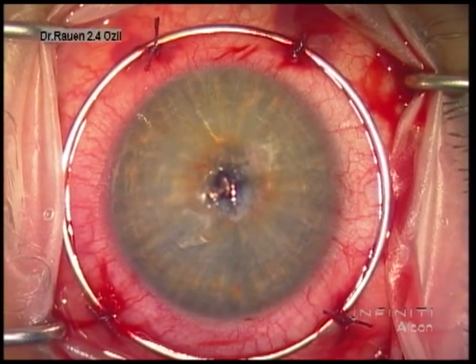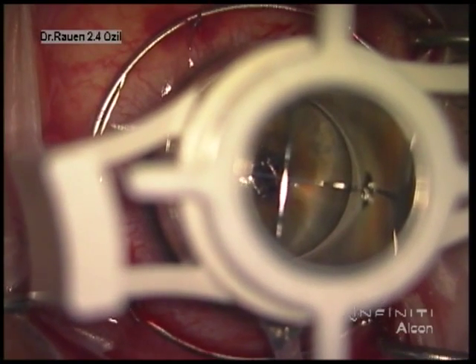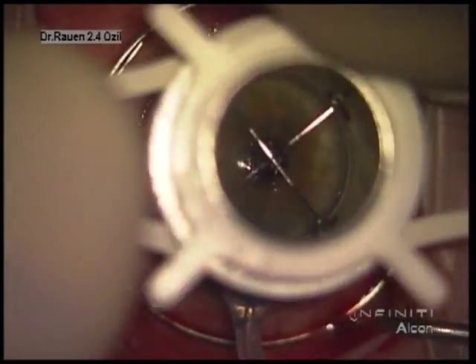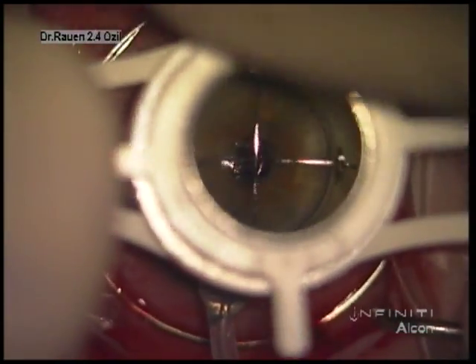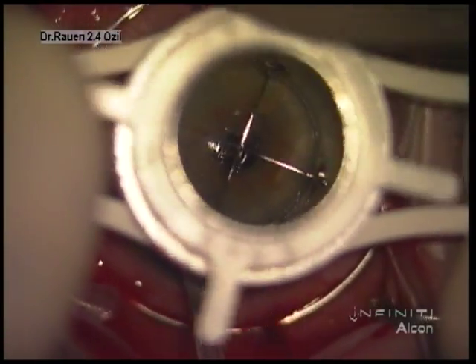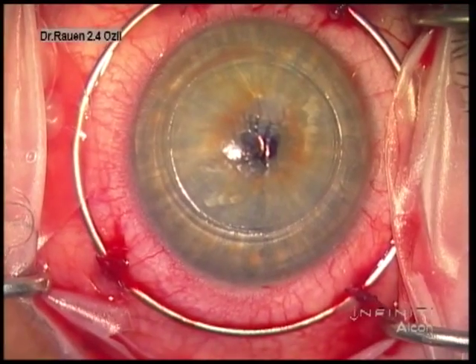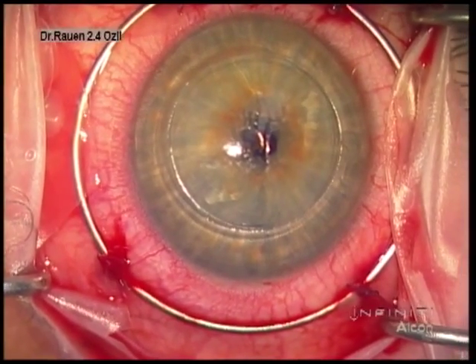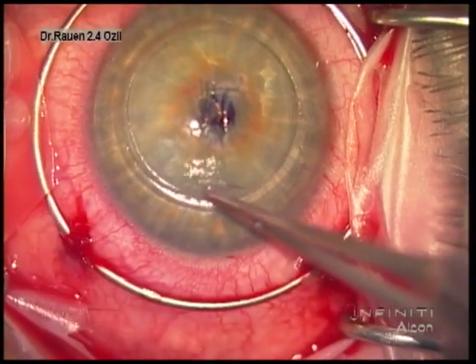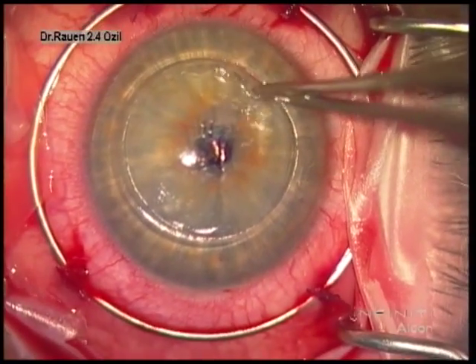We begin the procedure with a stabilization ring fixed to the eye. We mark the center of the cornea and then use a vacuum trephine to initiate a groove into the cornea. Prior to the procedure we like to obtain Pentacam images in addition to an examination at the slit lamp, as it gives us a sense of how thick the cornea is throughout its entire area. In this particular case the patient had a corneal thickness that was at least 380 microns and above throughout.